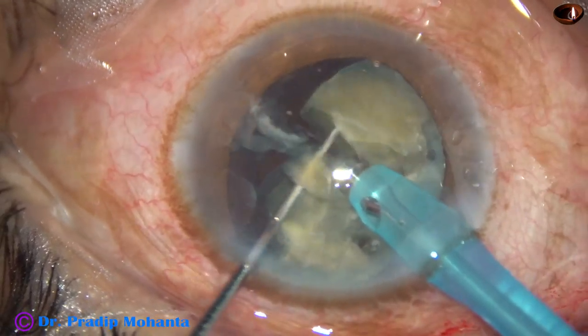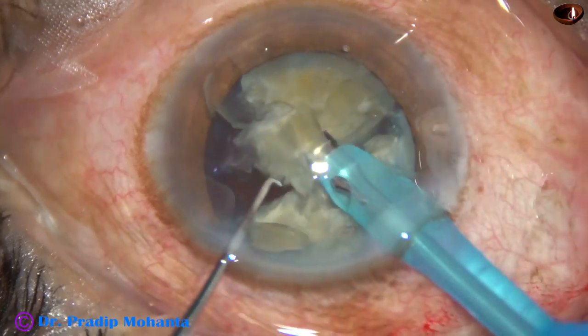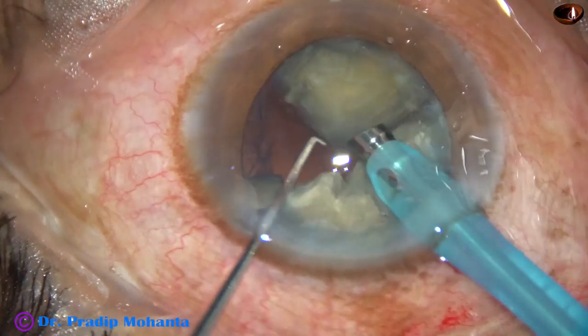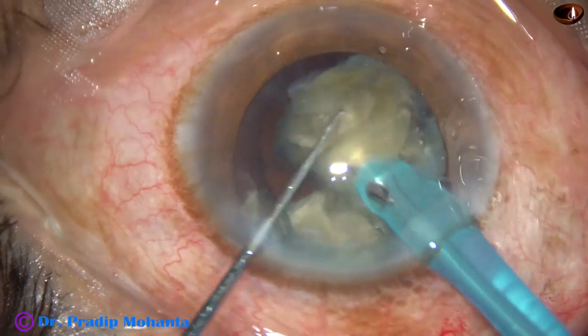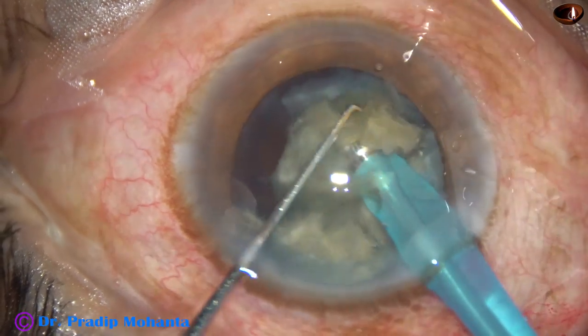Now each element is emulsified with ultrasonic energy. The ultrasonic energy used in this case is 70%, the flow rate is 40 ml per minute, and the vacuum is 400 mmHg.